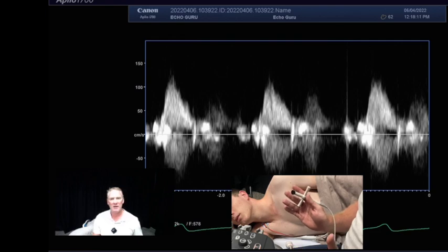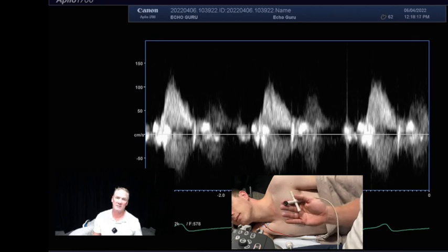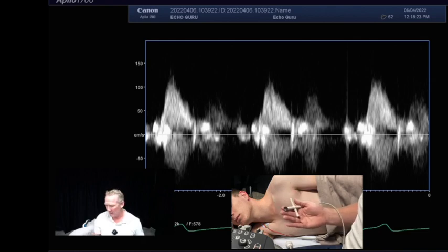A lot of people say you only do this in aortic stenosis. Practice on normal people, because a lot of the time we're going to get our highest velocities from this view. So you want to make sure that you're comfortable doing it. You saw then that didn't add any extra time to my scan time. If I'm already looking at the aorta for whatever reason, then it took me less than a minute to get a PEDOF image there. So it's really not a long time.